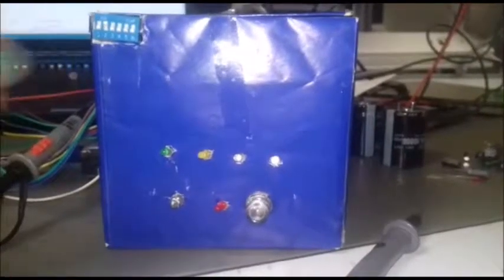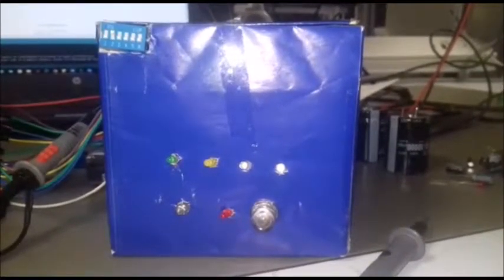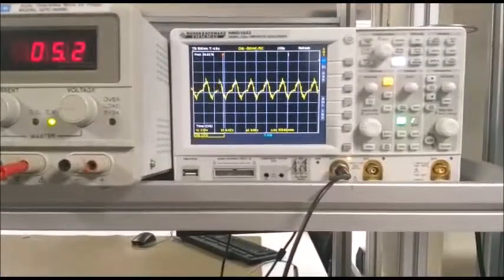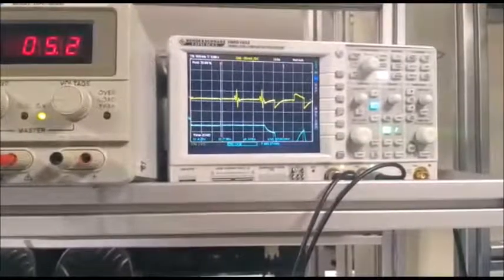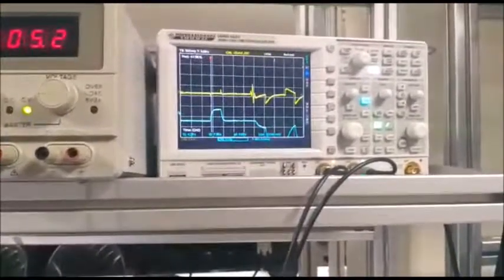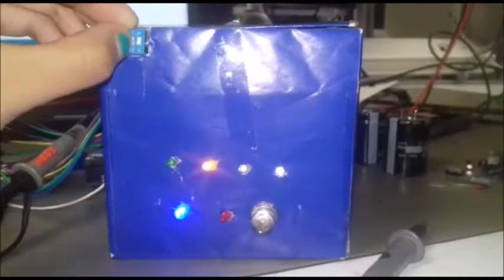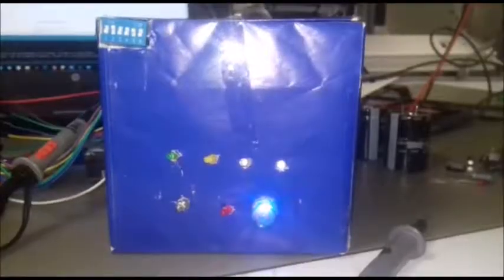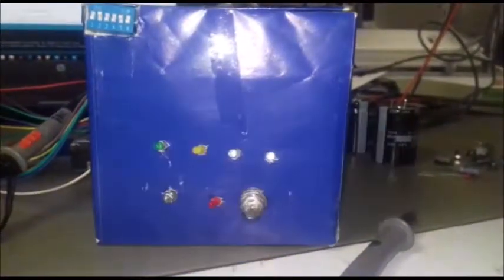The equipment is also designed so that the patient can recover after some of the discharges. And in this scene, in fibrillation the patient is discharged with 75 joules of energy, and then revived with the ECG signal under normal condition, and the multicolored LED lights up.